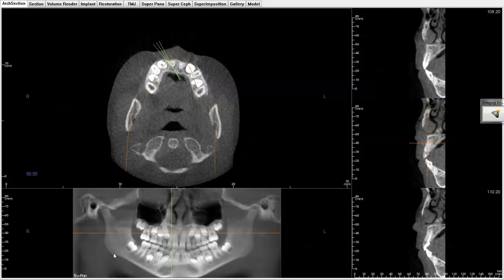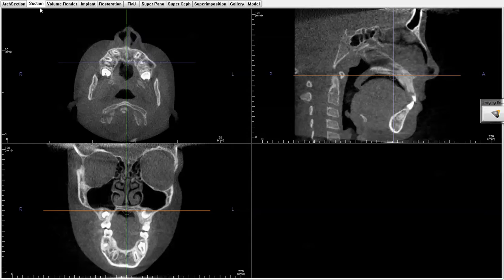What I'm going to show you is how we can look at the airways in three dimensions and see way more than what we can see on this X-ray. I'm going to draw your attention to this one on the top right. You can see this little area right here is adenoid tissue and it's a little bit enlarged in this particular patient.